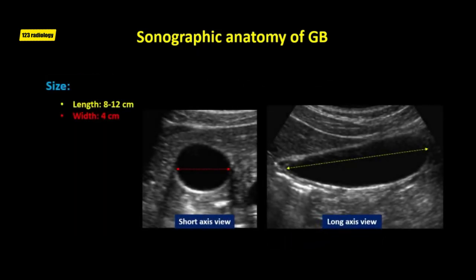The upper limit of normal transverse diameter of the gallbladder is four centimeters. The length of a normally distended gallbladder is variable but generally does not exceed 12 centimeters. Hydrops is considered when gallbladder length is greater than 12 centimeters and width greater than four centimeters. The length and width of the gallbladder are measured in longitudinal and short-axis views.